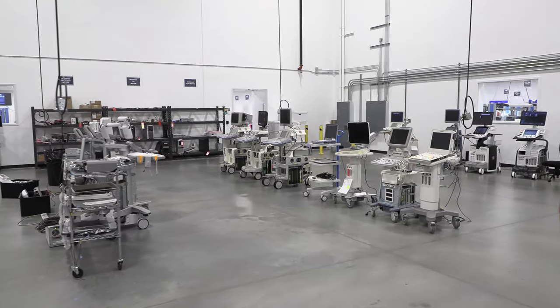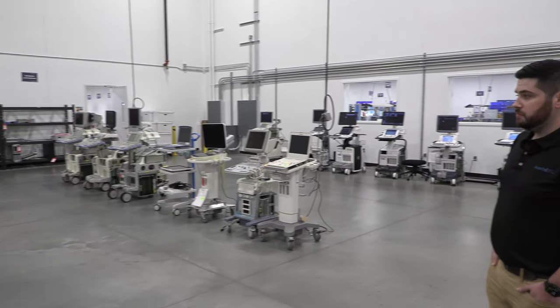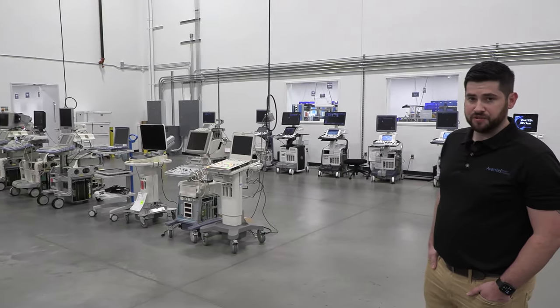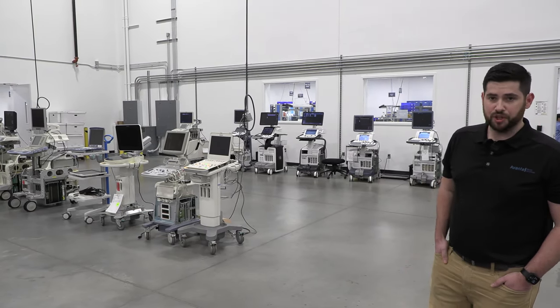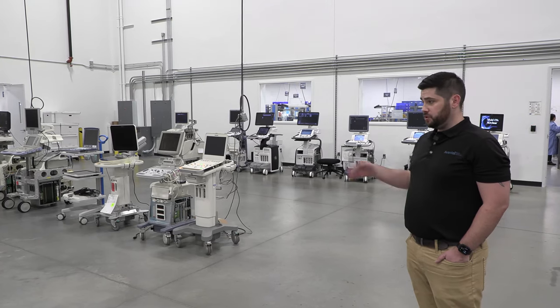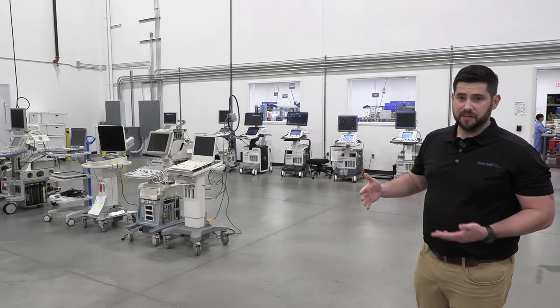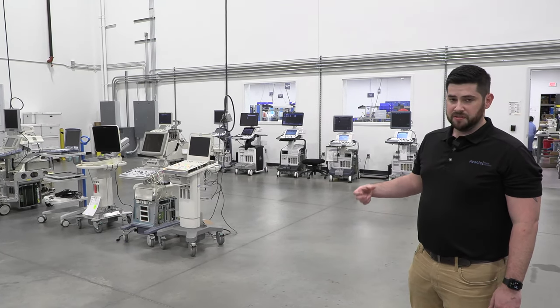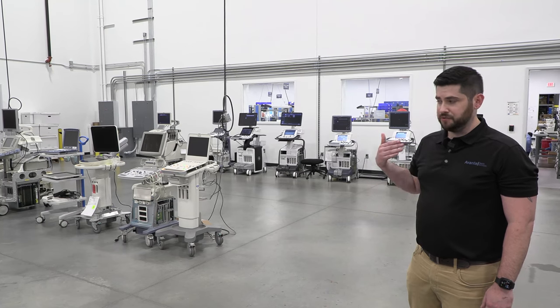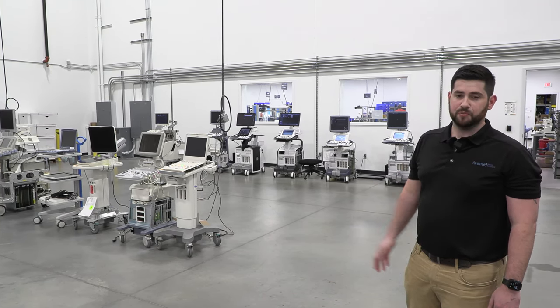All right. Well, if you look over here, all the systems that we have, this is what we use for our live scanning on our ultrasound probes. We can test most manufacturers, all the major manufacturers: GE, Philips, Siemens, Sonosite. We have a breadth of equipment that we can use. We can do a scan test through all the different modes on the probes. Then we use a tissue mimicking phantom as well as our actual tissue to verify the repairs that we're completing and the function of the probes.